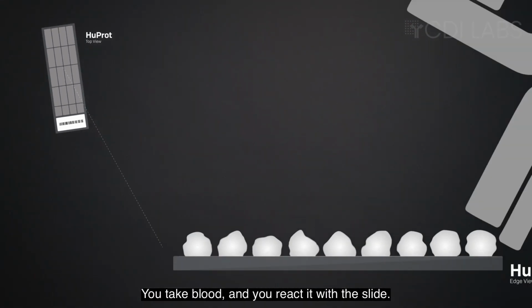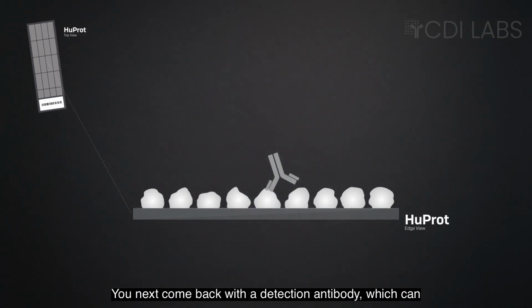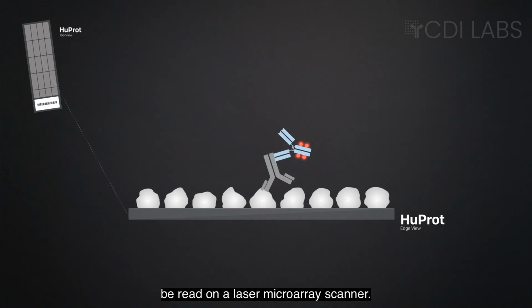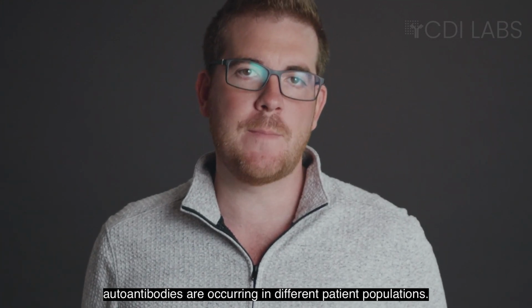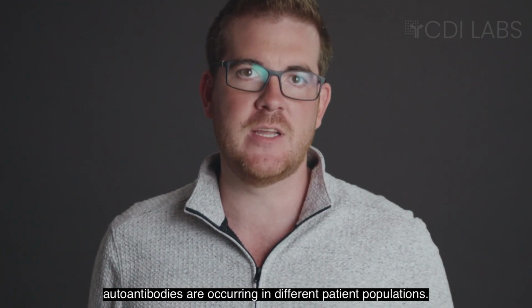You take blood and you react it with the slide. You next come back with a detection antibody, which can be read on a laser microarray scanner. The intensity of the light will identify which unique autoantibodies are occurring in different patient populations.